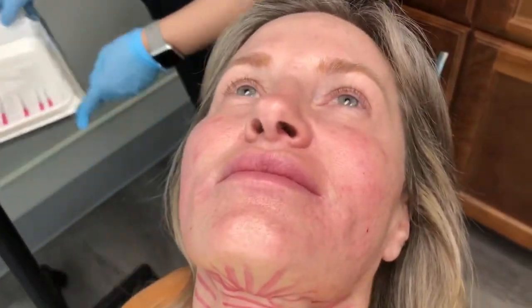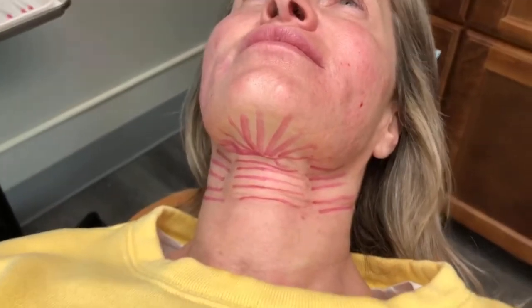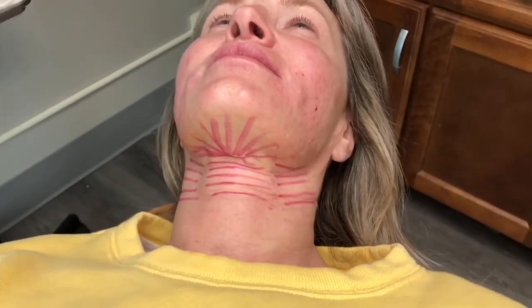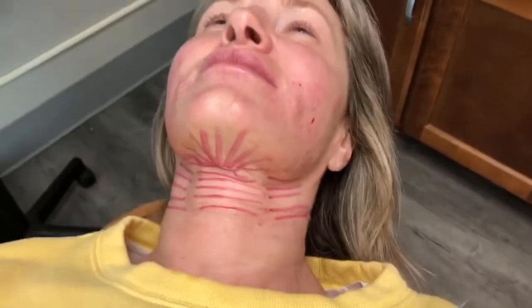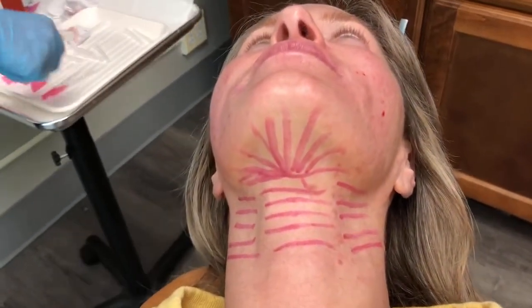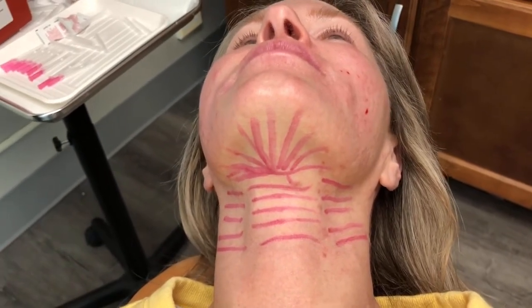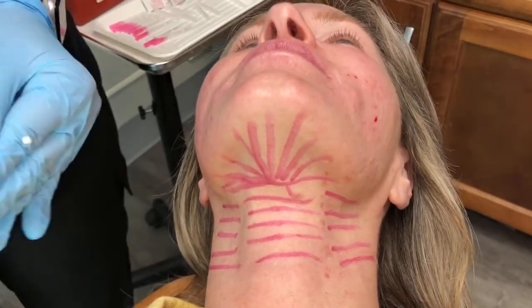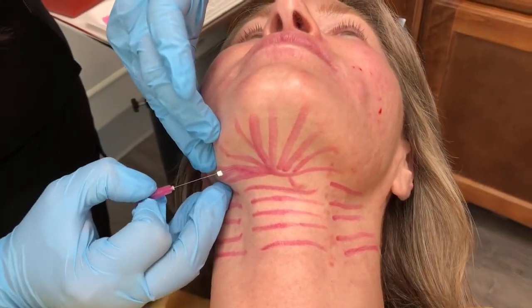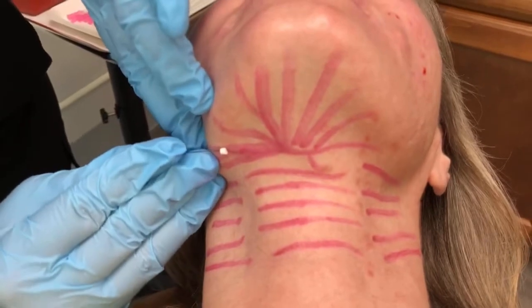Now let's go ahead and go to the chin — the magical chin. Everybody wants that chin. We want to get rid of that submental fat and tighten that chin. Getting rid of submental fat permanently, we can certainly also use Kybella, but the problem with Kybella is it will not tighten skin, and you get all this swelling.